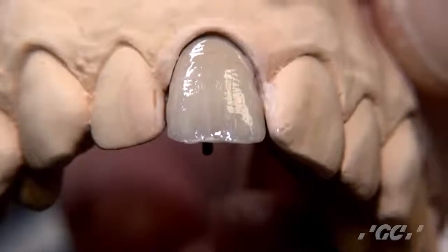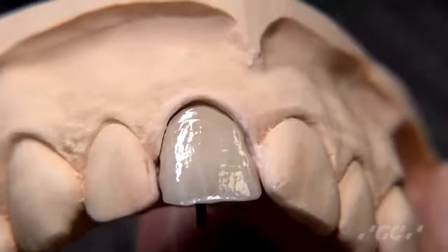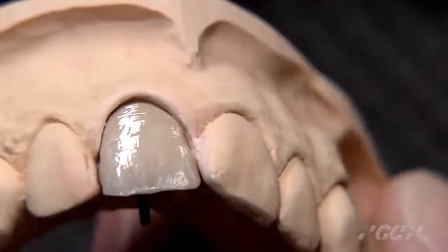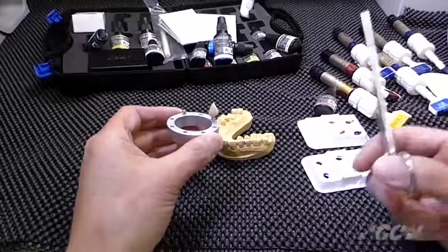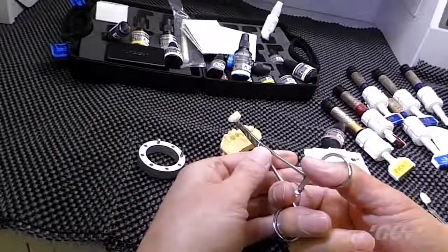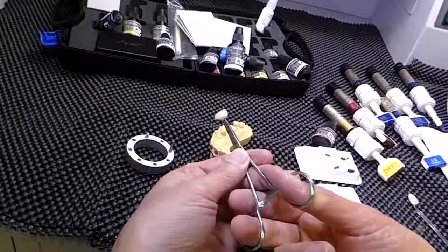It's very easy to create those colors. Then after that, before you apply the enamel layer on top of that, I'd like you to cure. After 5 minutes light cure, this is what it looks like after light cure for the internal stains.